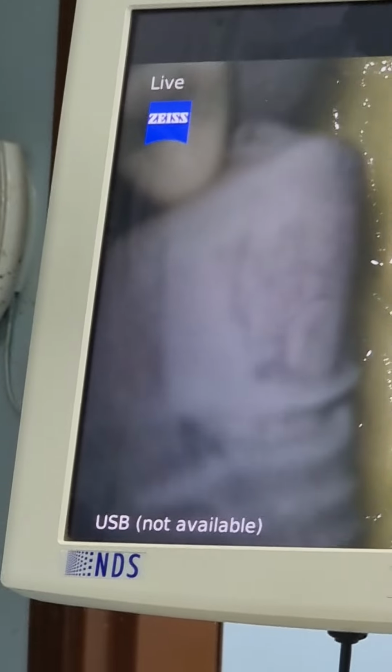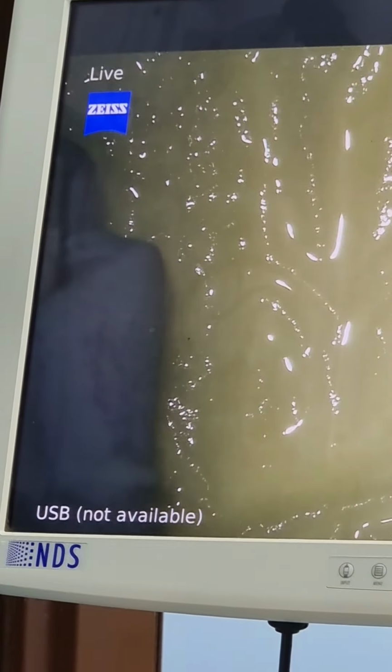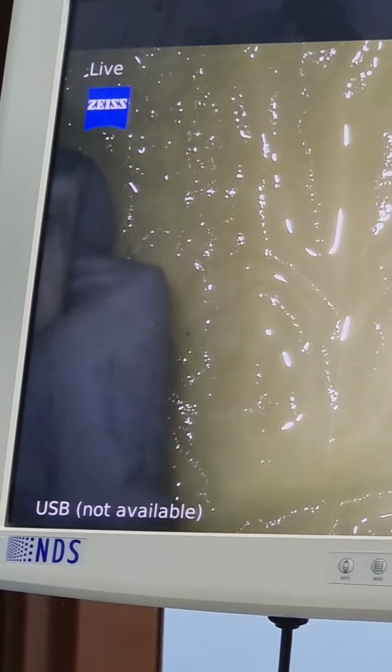You have to choose a proper size of burr when you start your cavity preparation. As I told you, a number 4 round burr is good, and when choosing the taper fissure burr, don't choose one which is very big, broad or wide. Obviously, a bigger burr will cut more tooth structure. So choose a smaller or optimum size of burr.